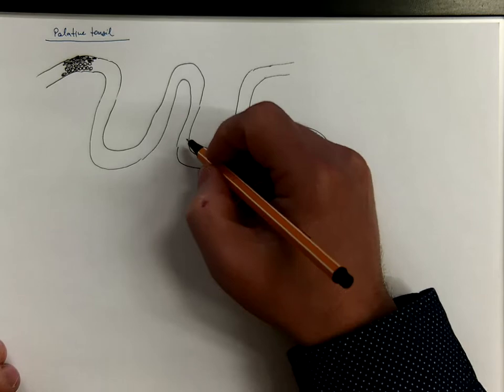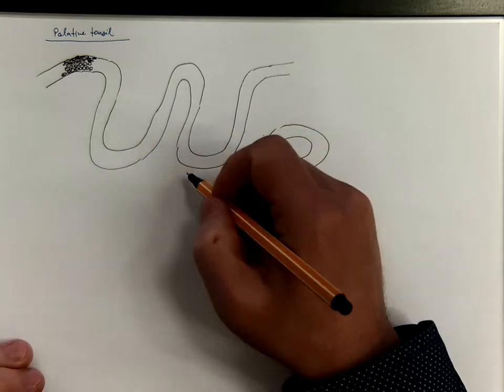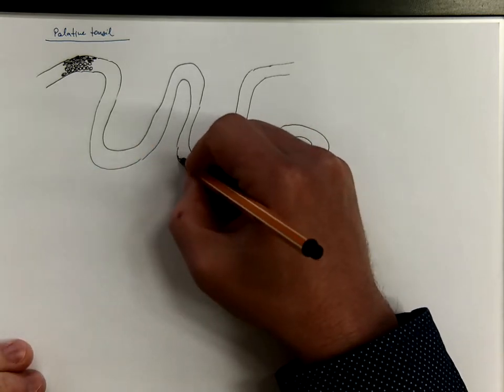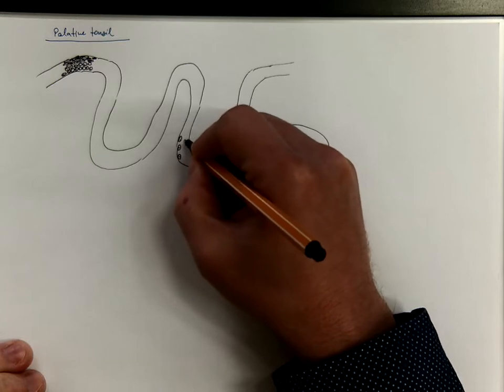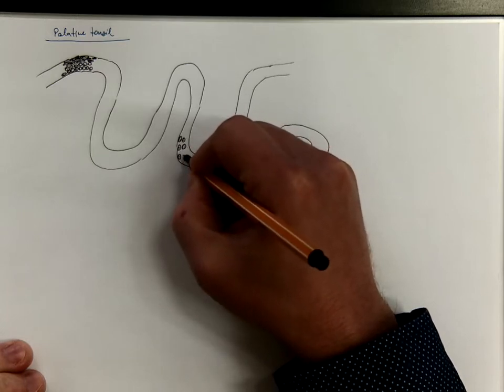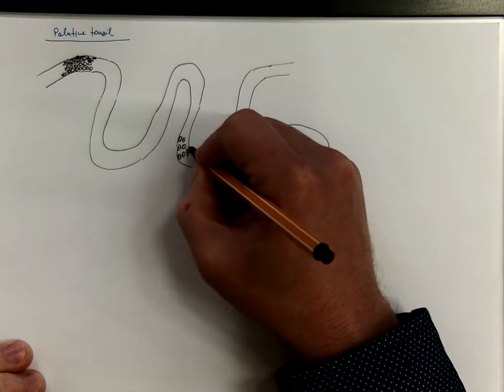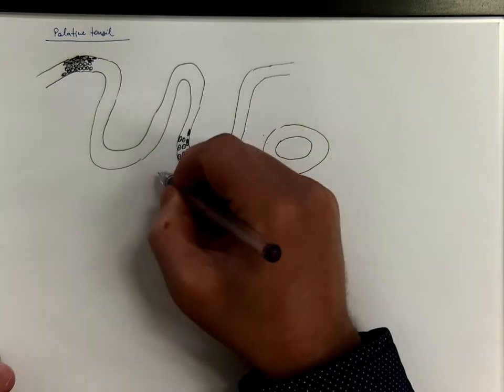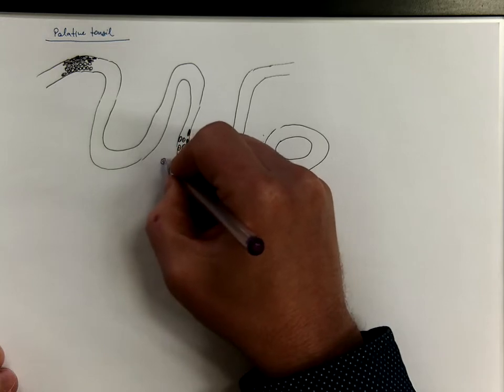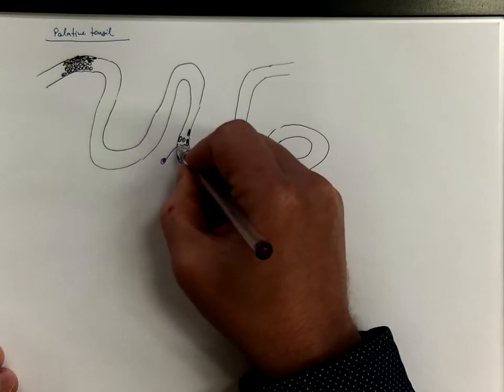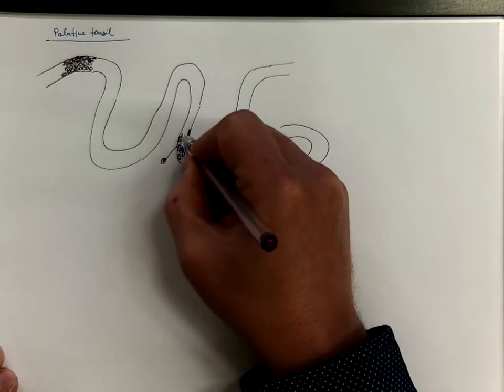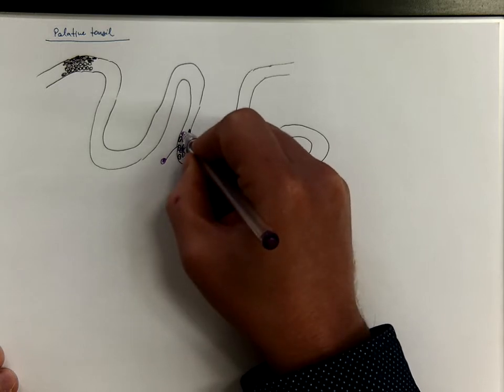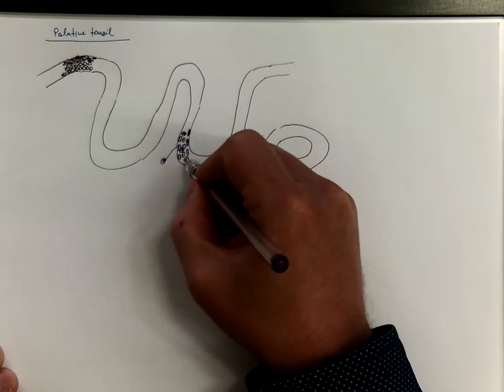However, in some regions, especially in the crypts, there are gaps between the epithelial cells, because the immune cells, the lymphocytes, are penetrating from the lamina propria into the epithelium. So you can actually find the lymphocytes inside the epithelium.